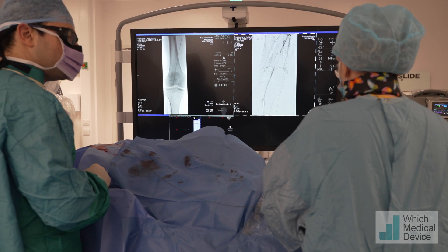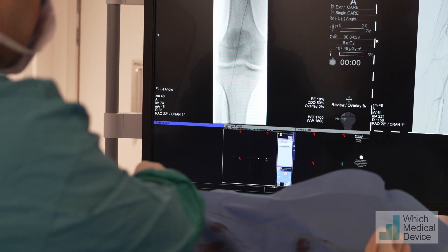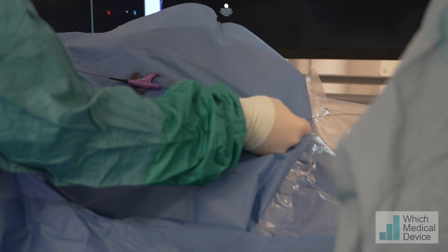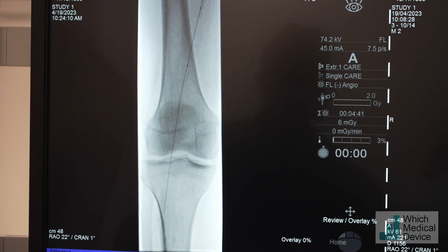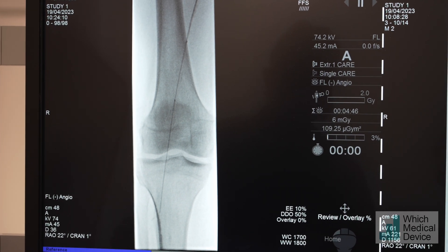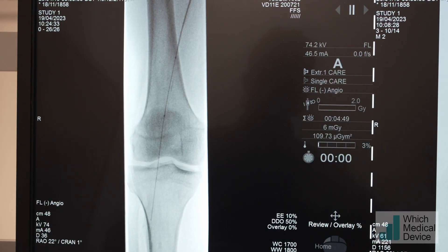So this is a six millimeter balloon - what does it say? Six by sixty - so six millimeters by sixty millimeters. We can see the wire at the end of the balloon and we hold the wire in place whilst we advance the balloon. I start screening at the point I feel I'm getting close, looking at the tip of the wire - I don't want it to move at all. We can use the bony landmarks to identify where we need to be.